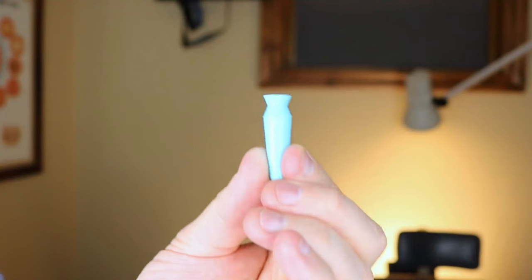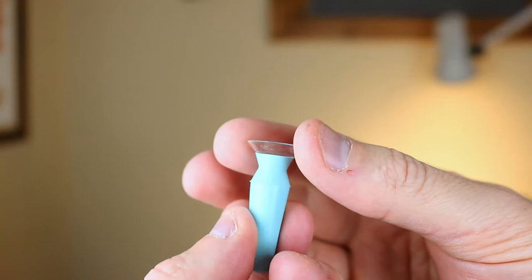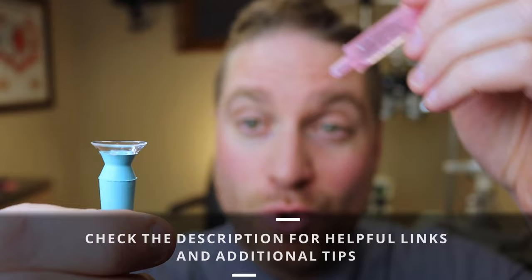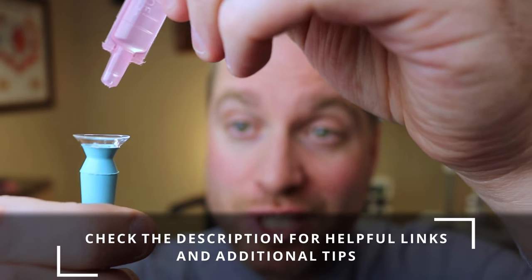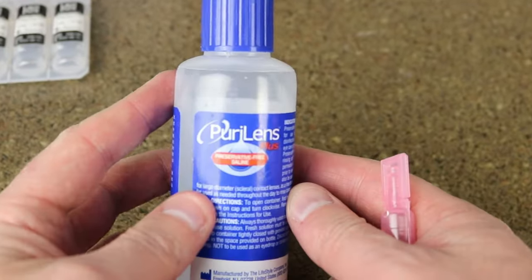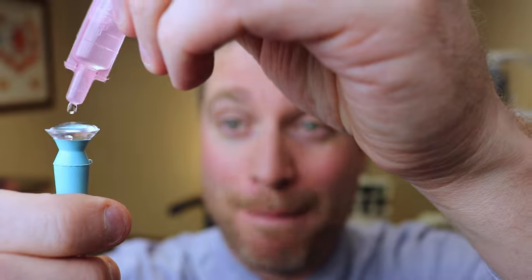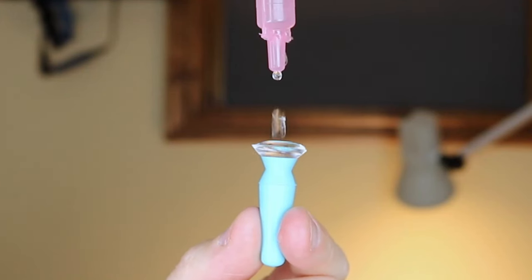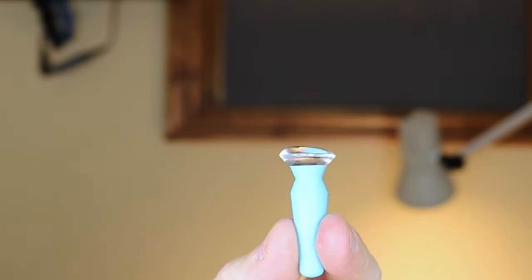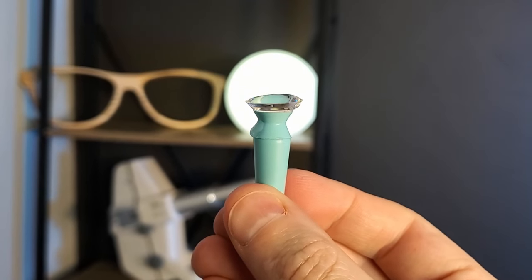The best tool to use, especially when you're starting out, is a plunger or a DMV plunger. You're going to set the scleral lens like a bowl, perfectly in the center of this plunger. Part of what makes scleral lenses unique is you're actually going to fill it with an improved pH balanced saline solution, and fill it completely full — full enough to the point where the solution is about to fall out. If you don't fill it completely full, this increases your chances of getting a bubble between the contact and your cornea, which can cause irritation issues and get in the way of your vision.